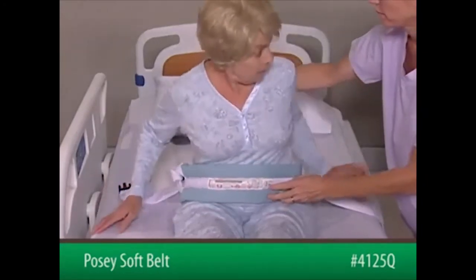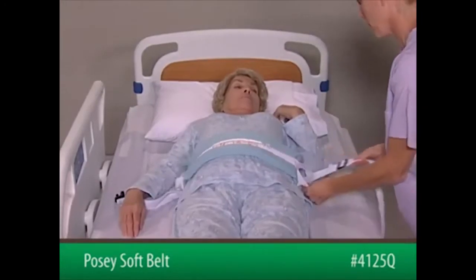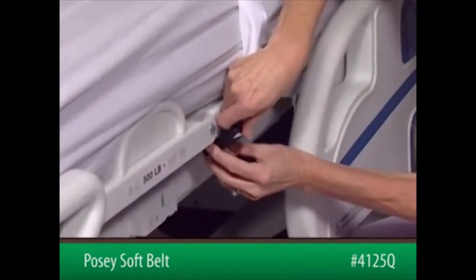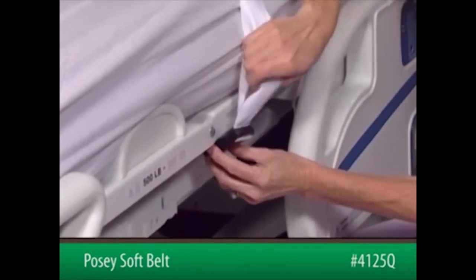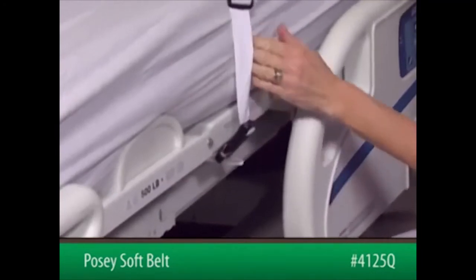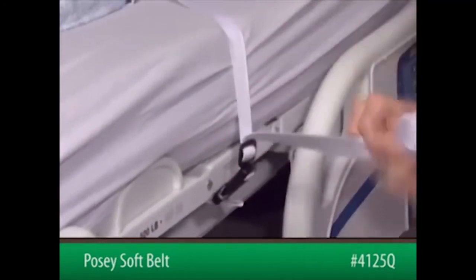Now, position the patient in bed. Insert the male end of the connecting strap into the female end of the short strap — listen for a snapping sound. Pull on the top strap to adjust the slack and move the slide buckle down to the quick-release buckle. Tuck any excess strap out of the patient's reach.